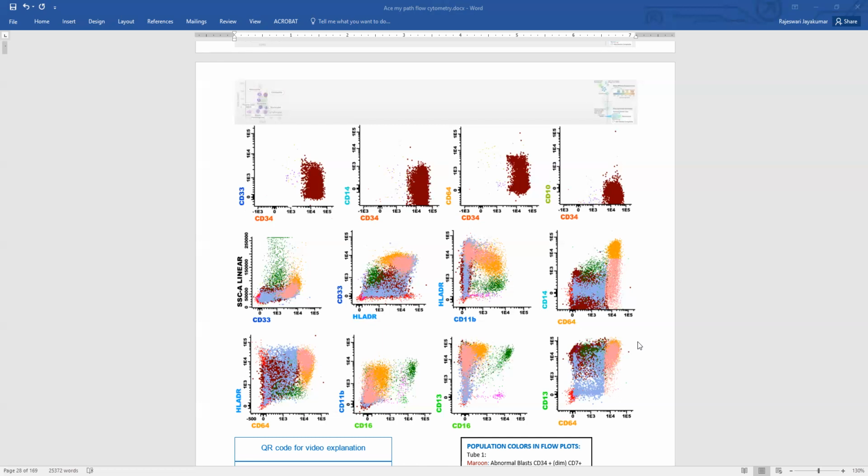You're going to say just acute myelomonocytic leukemia, or you can just say acute myeloid leukemia, and then you can mention what subtypes of population you see, like you have this much percent myeloid blasts, this much percent immature monocytes, and these many mature monocytes, consistent with an acute myelomonocytic leukemia, correlate with FISH studies. So this is another AML with recurrent genetic abnormalities. Thank you.